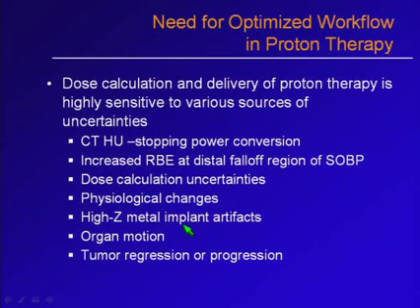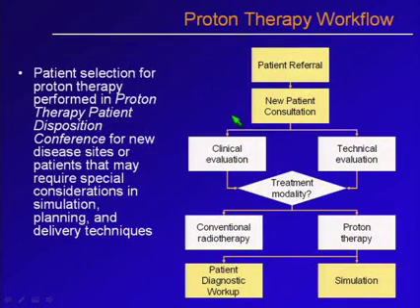And then there are physiological changes, high Z implant artifacts, organ motion, and tumor regression and progression. So here is a workflow that we look at as patient selection for proton therapy is done.